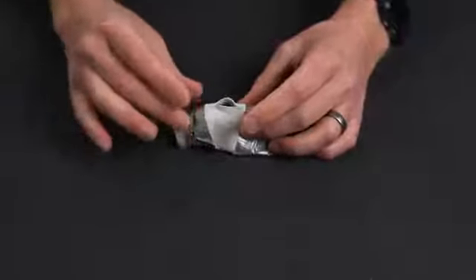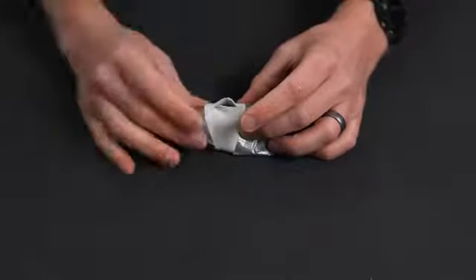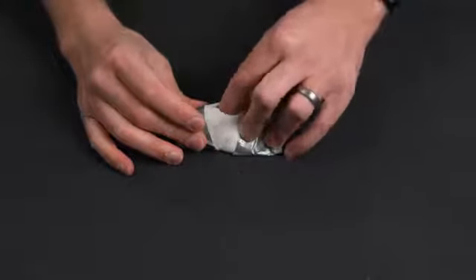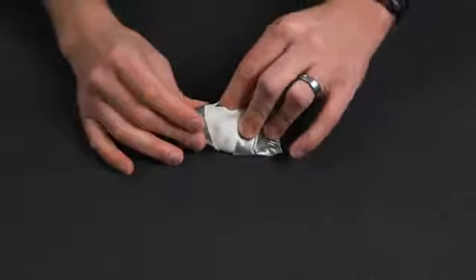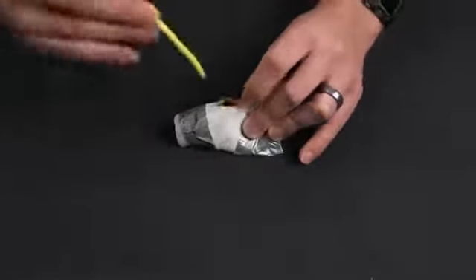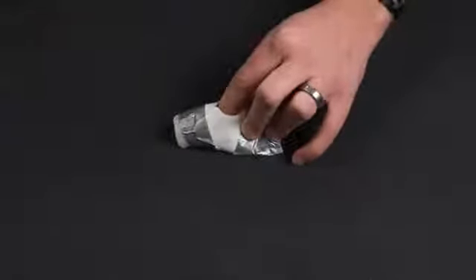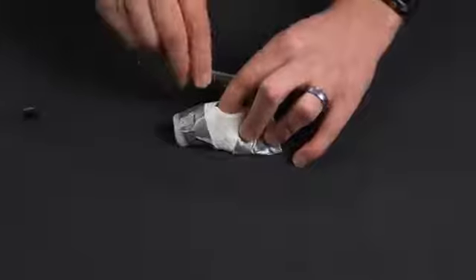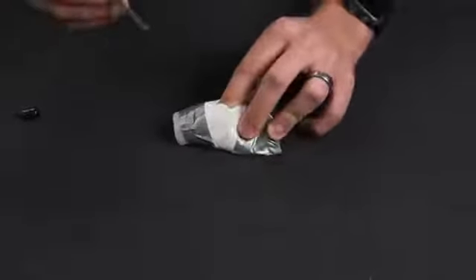And in a stressful environment, which this I guarantee you is a stressful environment, you will be unable to find it again. So it's really important to maintain this pressure here and try to have kind of a place saver in place. Now that could be your bougie, that could be your finger, or that could actually be a trach hook. Now, trach hooks can be inserted with your fingers still in.